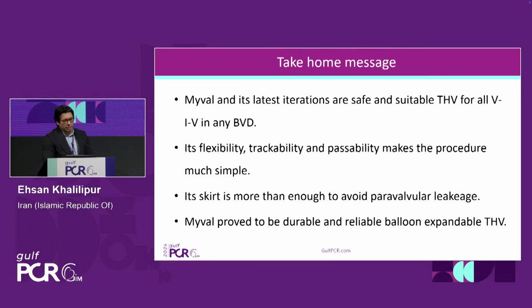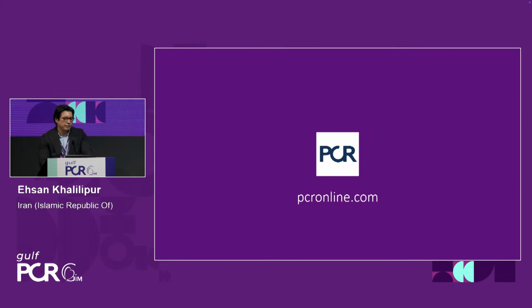Its flexibility, trackability, and passability make the procedure much simpler. Its skirt is definitely enough to prevent paravalvular leakage, and we think Myval proved to be a durable and reliable balloon-expandable THV. Thank you very much.